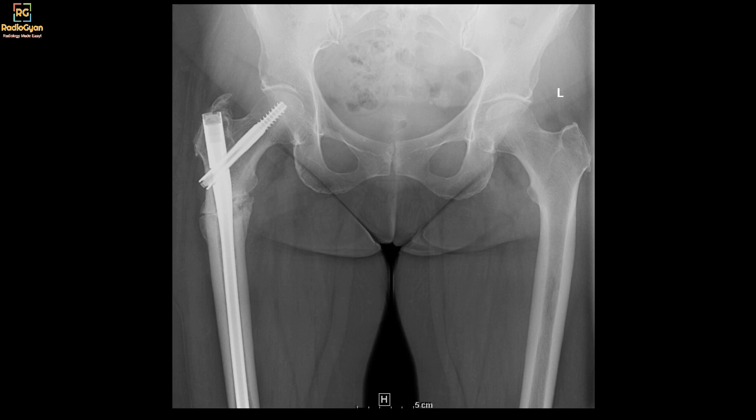The reason for the request for the radiograph — in fact she had come in for CT — was to see if there is any callus formation or union. Unfortunately, as you see in this radiograph, there's not much of bridging callus. There is some callus, but you can see that there is a persistent gap.